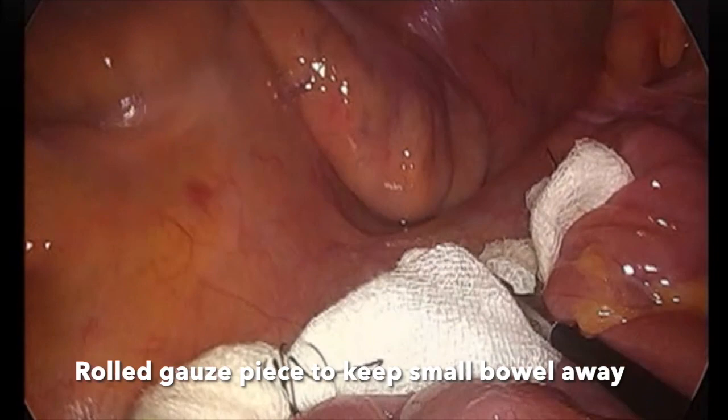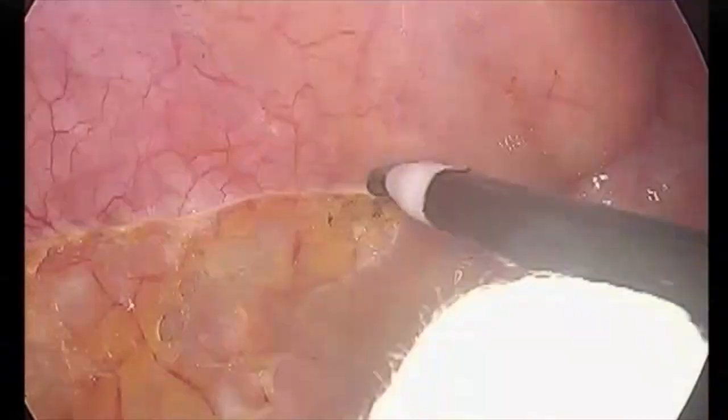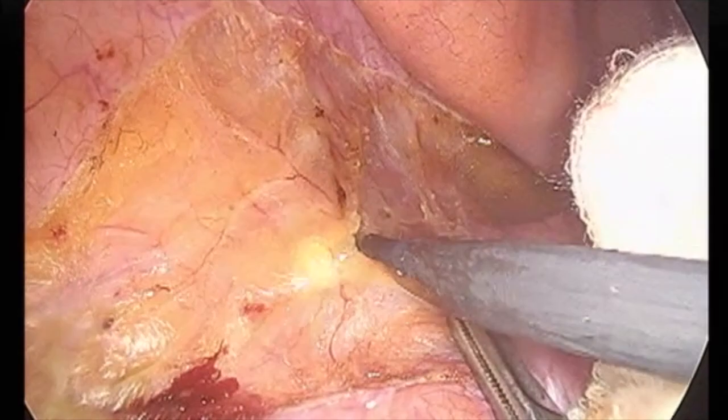After entry, a rolled gauze piece is placed to keep the small bowel loops away. Traction on the sigmoid mesocolon helps to make the peritoneum taut. Incision is made on the peritoneum just above the sacral promontory and extended inferiorly into the pelvis. Initially we prefer doing a posterior dissection and the right lateral dissection, followed by a left lateral dissection. The peritoneum incision is extended slightly above the sacral promontory.